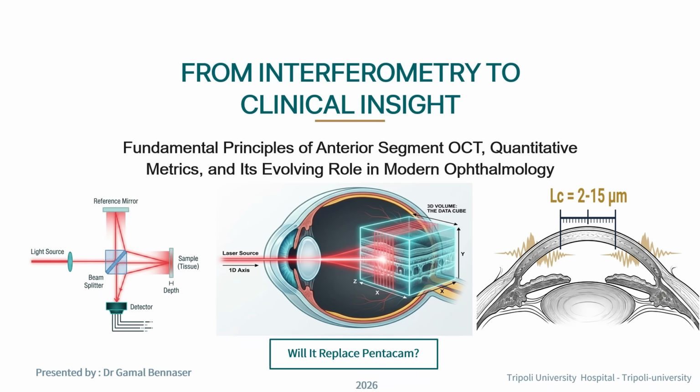So beyond the slit lamp, that we used for a long time for optical sectioning of the eye with this limited resolution, now we shift to the high resolution microscopic quality. That's the optical coherence tomography.